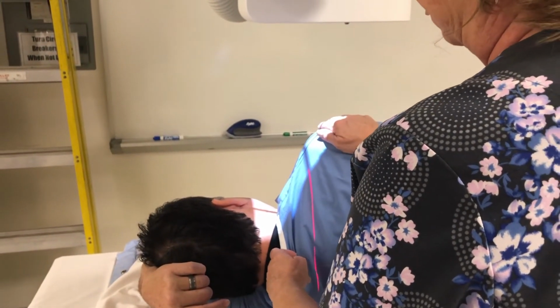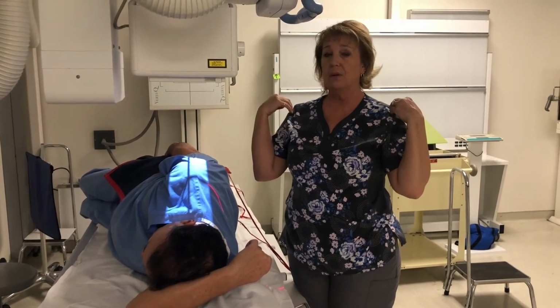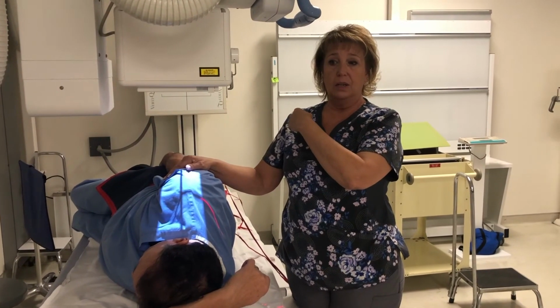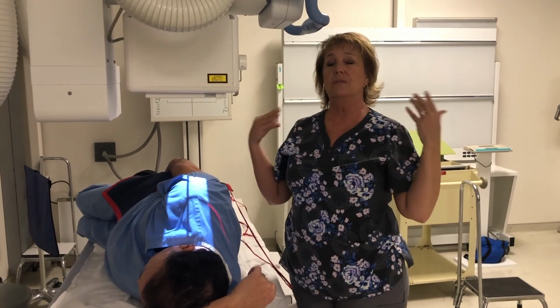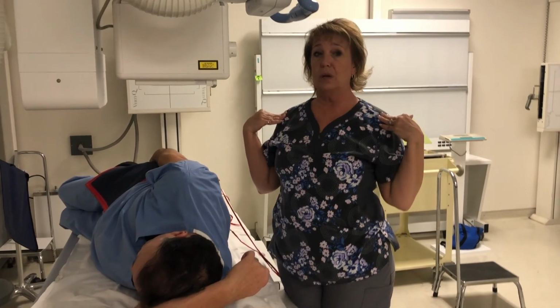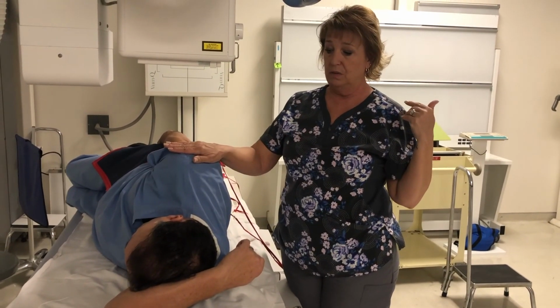A swimmer's view is always part of a thoracic spine series because on the lateral thoracic, you're never going to see C7 or C7T1. On a lateral cervical spine, you only include a swimmer's view if their shoulders are too broad or you didn't see the C7T1 junction. And on some people you can. Depends on how much their shoulders slope. So it's as needed on a cervical and always on a thoracic when you do a swimmer's view.